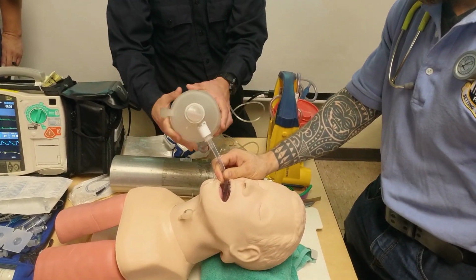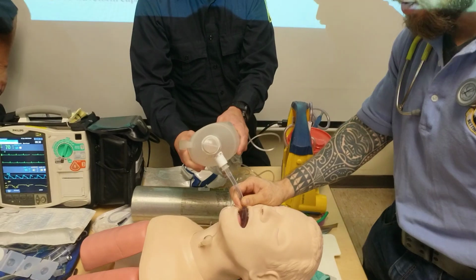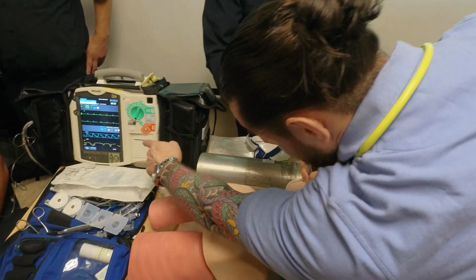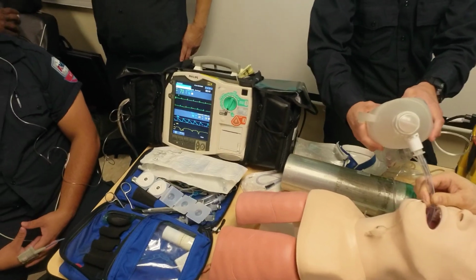Capnography. What's the number? 35. Squeeze the bag, sir. Right? Do I have chest rise? Yes, but I'm not sure yet. I look at the number. Oh, it's 42. Squeeze. Am I in the lungs?